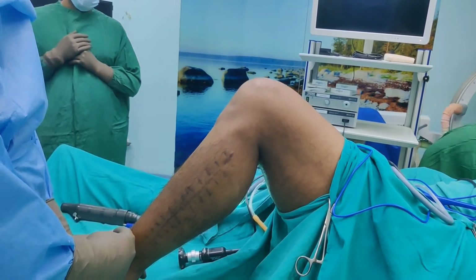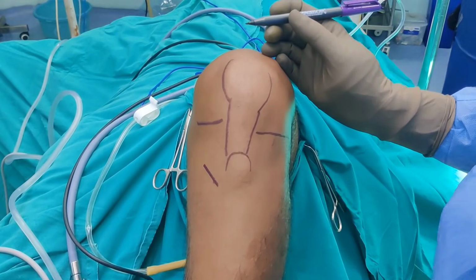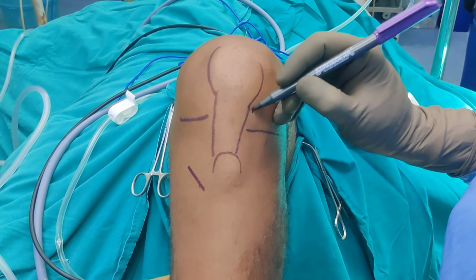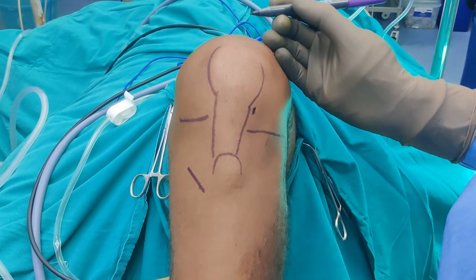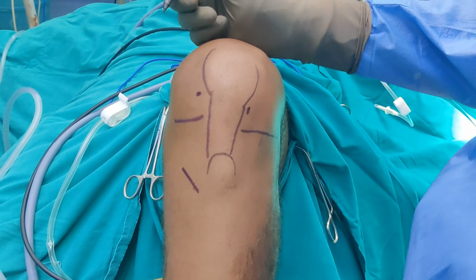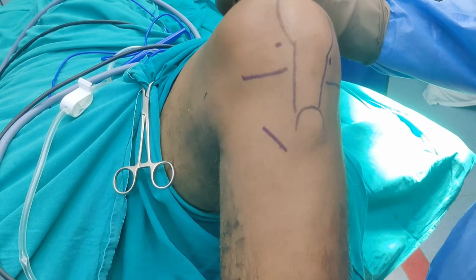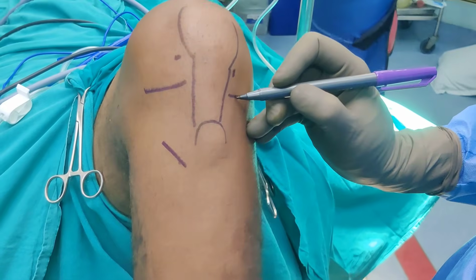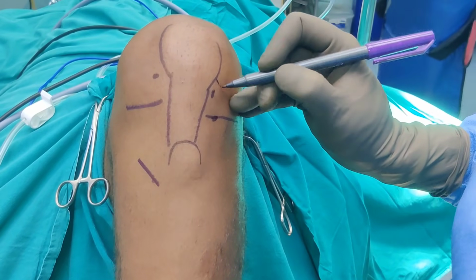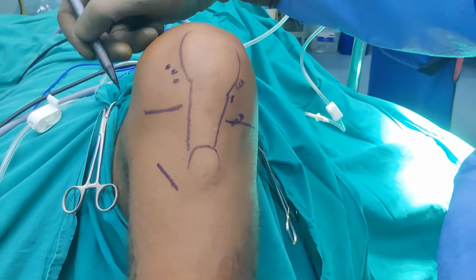So next I will show you the portals that I will be using for this particular operation. There will be various portals. The first portal that we will be making will be this high anterolateral portal. So this will be our entry. Then we will be making an anteromedial portal. Then under vision, when my scope is in, we will be making a posteromedial, and then the last portal that we will need is this low anterolateral portal. So the high anterolateral portal, low anterolateral portal, anteromedial portal and posteromedial portal.